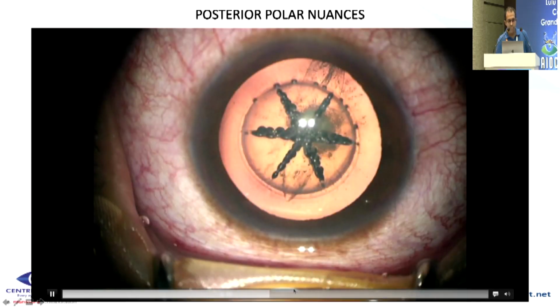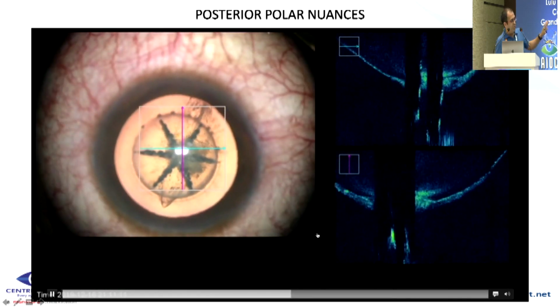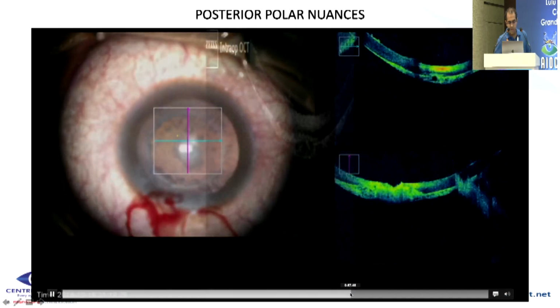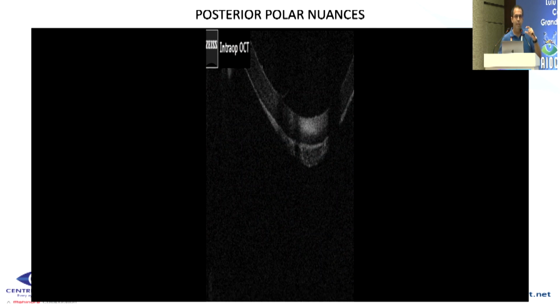So once this is done, this is our intraop OCT. It shows very well that there is a discontinuity on the posterior capsule. So we go ahead, look at this, how beautifully we can see that the posterior capsule is damaged. We do our surgery. Once the cataract is removed, what I want to show you is this. Because of that 1000 micron offset, we have essentially created a new posterior capsule. So that 1000 micron epinucleus is saving our nucleus from going down, and that is holding all the turbulence. So though there is a discontinuity, we could do a phacoemulsification very well.